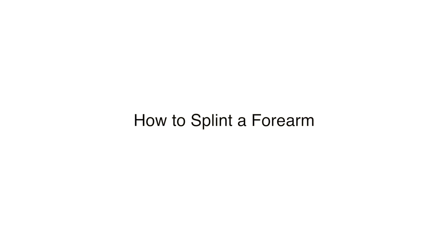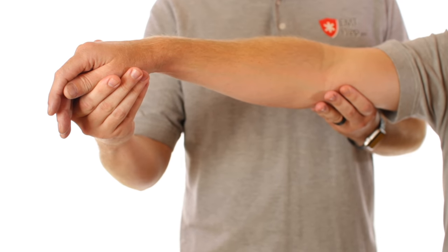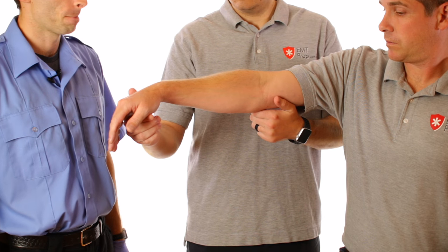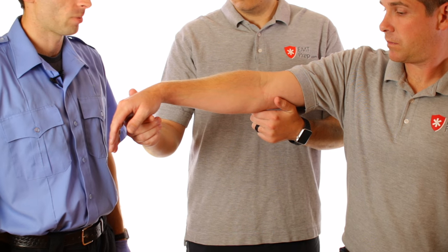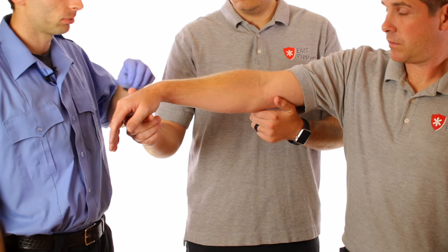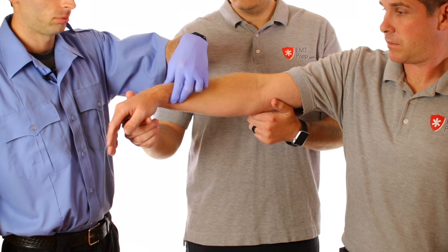Have your partner support the extremity above and below the injured site. In this video, we are simulating a mid forearm fracture. Ensure that you have circulation, motor ability, and sensation in the injured extremity.